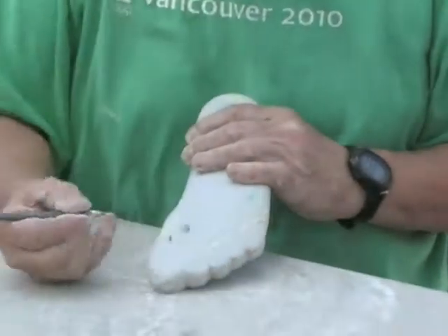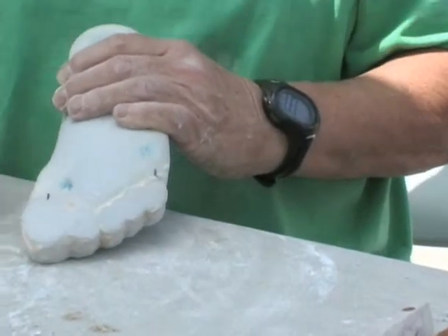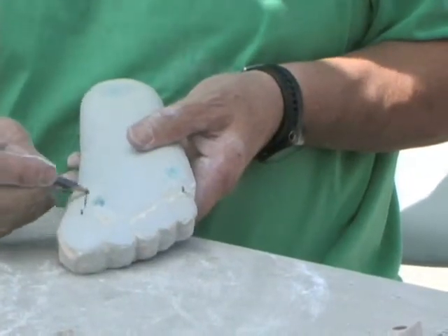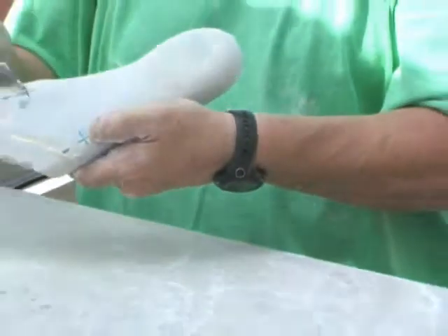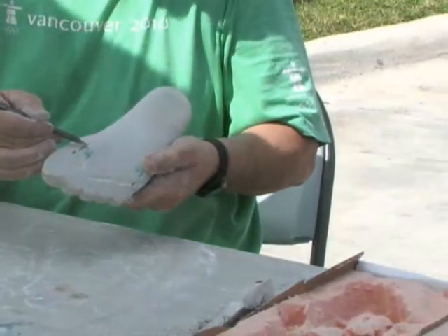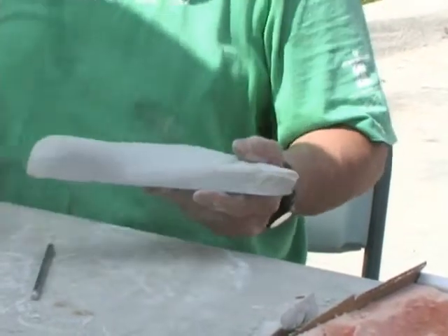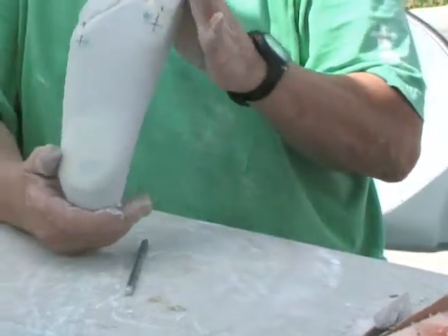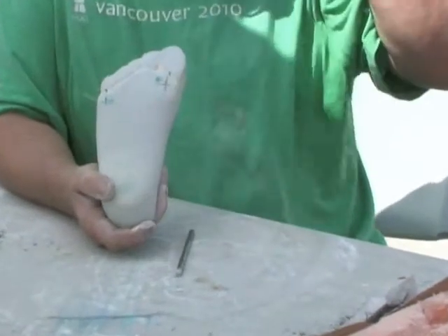What we do is we mark the center of the first and the center of the fifth metatarsal. This area right in here is going to be Laura's bisection of her first and fifth. Those marks are very close — I'm very happy with this. I'm finished with the filing and the first step of preparation. The marks are very close and good — I usually use about a quarter of an inch.